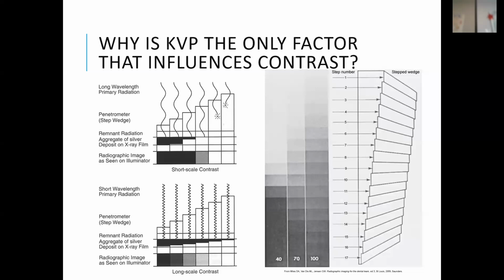So yeah, this is like going way back. But can you remind us? Okay, so KVP is the power when it pushes it to the other side. Yeah, it accelerates. The MA controls how many electrons are in your electron cloud, and the KVP accelerates them to the tungsten target. And you guys don't ever change that. You never change it on your machines typically. It's just set.